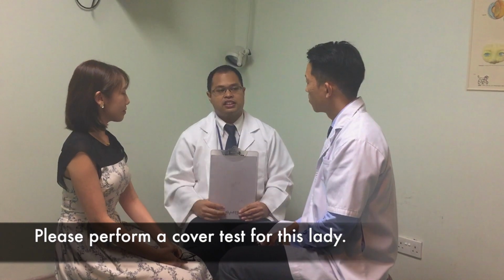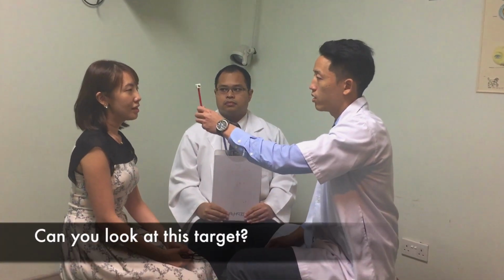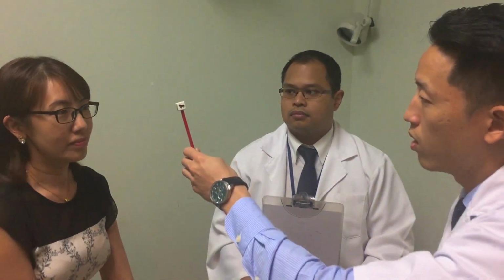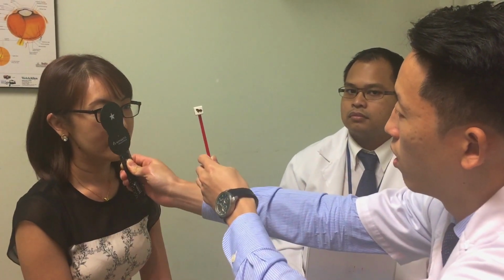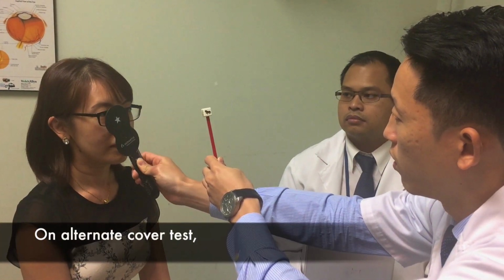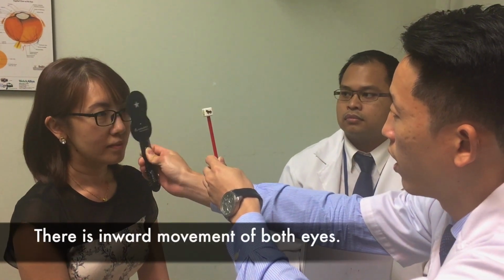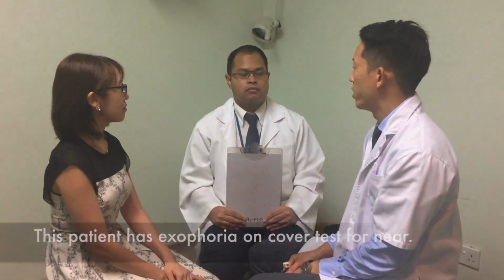Good morning, doctor. Good morning. Candidate U, please perform a cover test on this lady. Okay, doctor. Ma'am, good morning. I'm Dr. U. I would like to examine your eye. Is that okay? Yeah, okay. Can you look at this target? I need to wear my glasses first. Okay. Can you see this target now? Okay, much better. On covering of the left eye, there's no movement on the right eye. On covering of the right eye, there's no movement on the left eye. On alternate cover test, there is inward movement of both eyes. In conclusion, this patient has exophoria on cover test at near distance. Okay, very good.